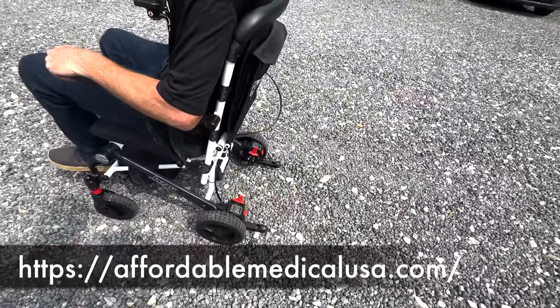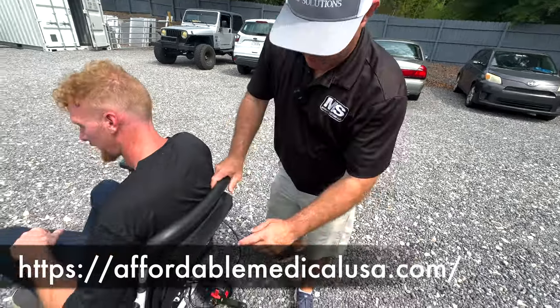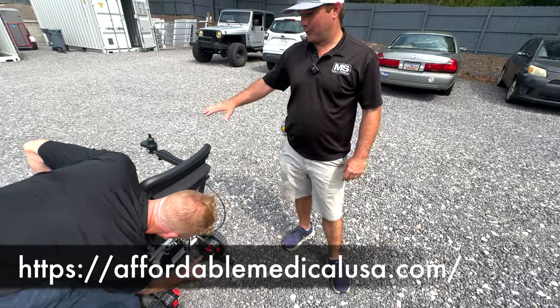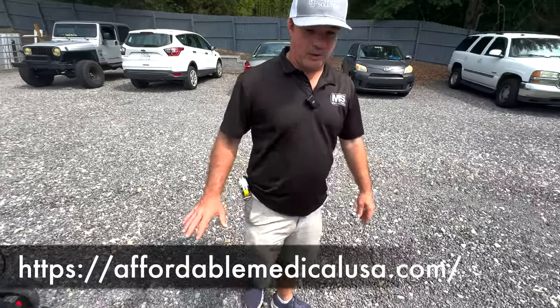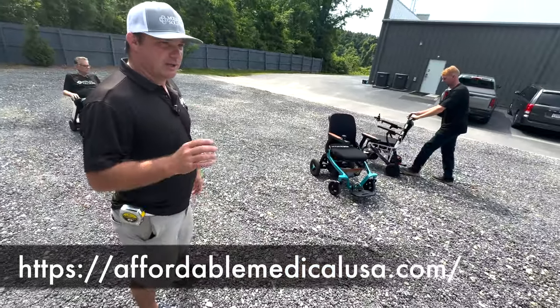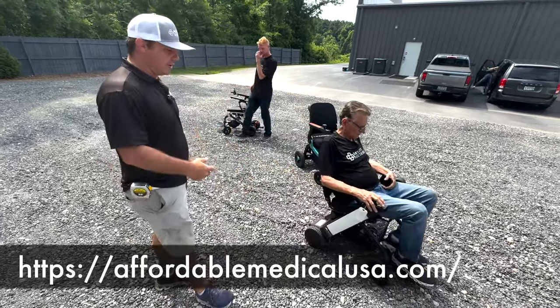All right, let me explain something. If this happens to you and you have one of these chairs, most of the time people have mobility and need this for distance. You might have to get out of this, put this in freewheel, and get it through the situation. This is just what it is. If you're buying this to go through this stuff, don't buy it. Don't buy any of these three power chairs if your primary use is really thick gravel. If your driveway is gravel but it's compact and not so thick, you should be fine going down to the mailbox and back. In a way, it's almost like buying a pair of shoes. I hate to say it. You got your work shoes, you got your running shoes, and you have your boots.